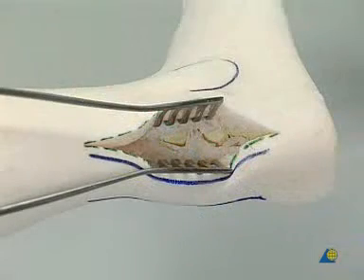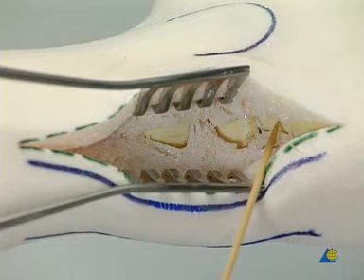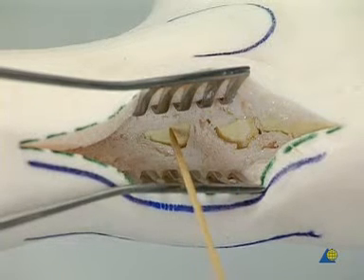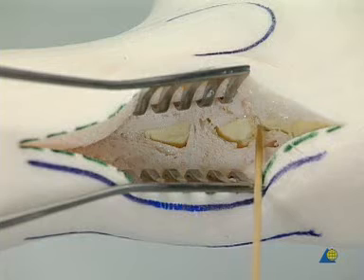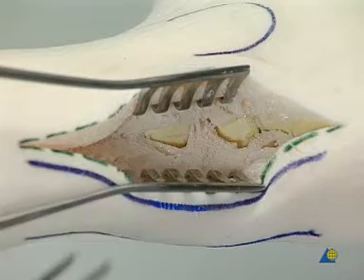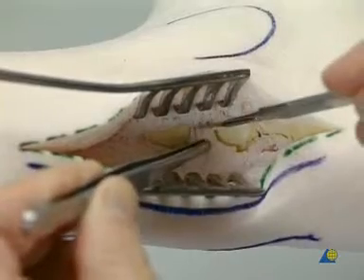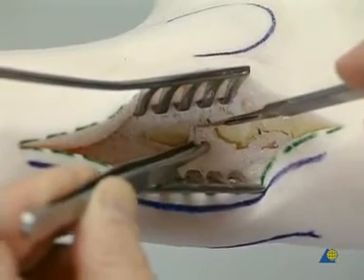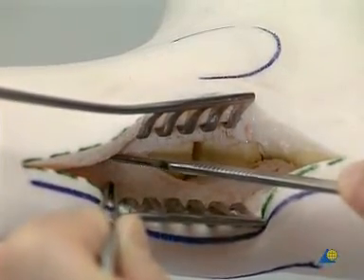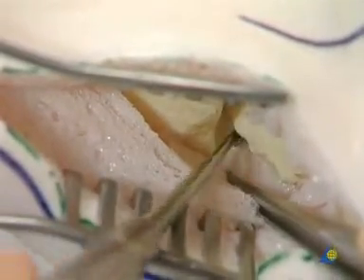The self-retaining wound spreaders hold the wound open. Here the calcaneus, the talus, and the tibia are shown. This is the subtalar joint and the ankle joint. The posterior aspect of the ankle joint is approached through a capsulotomy. The foam that has infiltrated the joint is removed. The approach to the tibia is extended proximally.